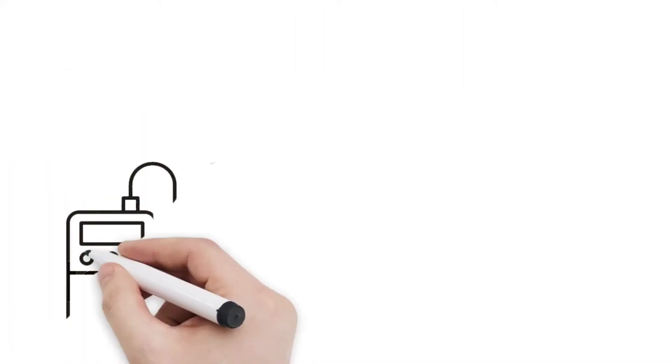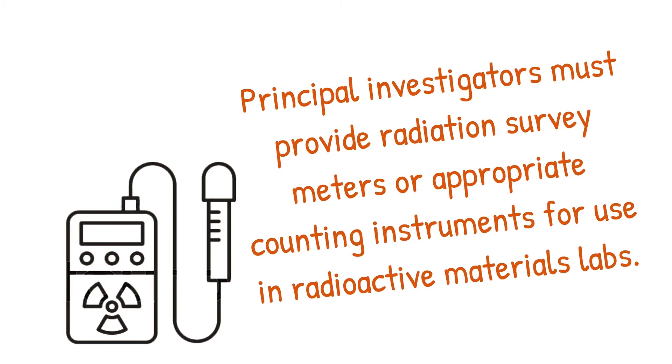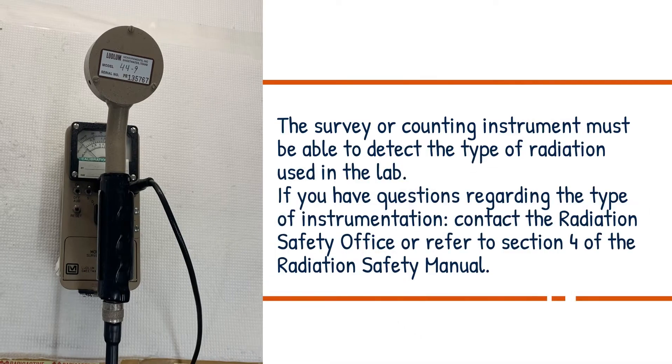Principal investigators must provide radiation survey meters or appropriate counting instruments for use in radioactive materials labs. The survey or counting instrument must be able to detect the type of radiation used in the lab. If you have questions regarding the type of instrumentation, contact the Radiation Safety Office or refer to Section 4 of the Radiation Safety Manual.